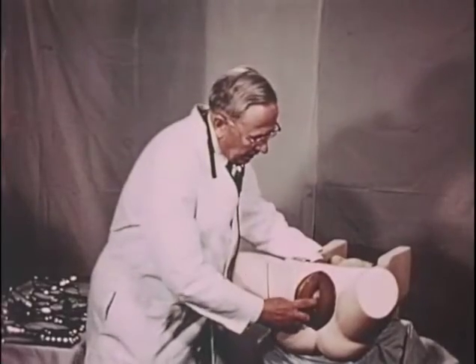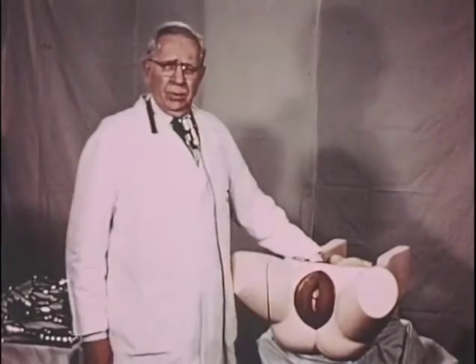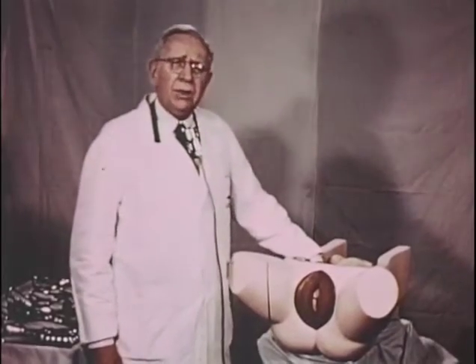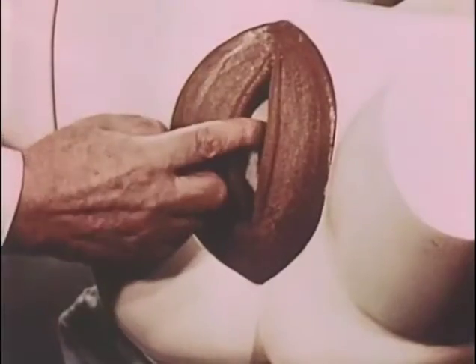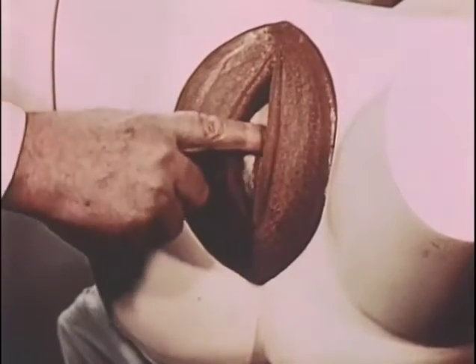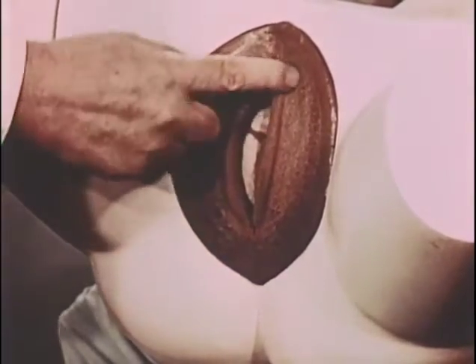And since this is a demonstration of an application of the forceps to an anterior position, our sagittal suture we find is in the right oblique with the posterior fontanelle opposite 1 o'clock.